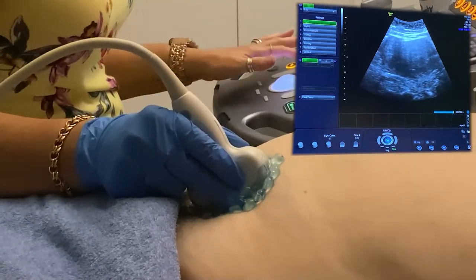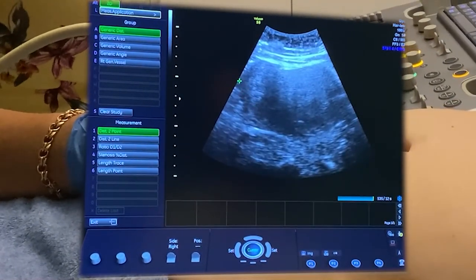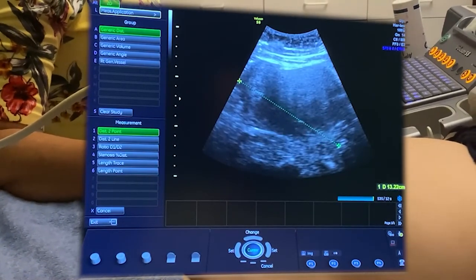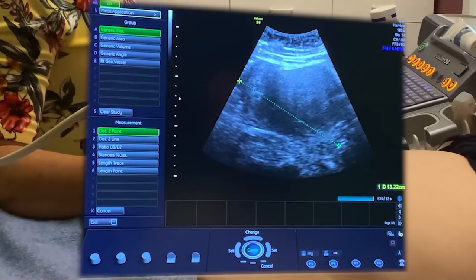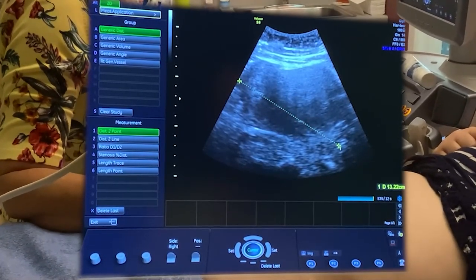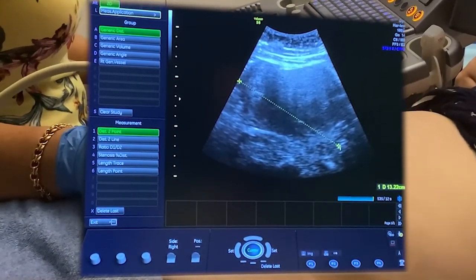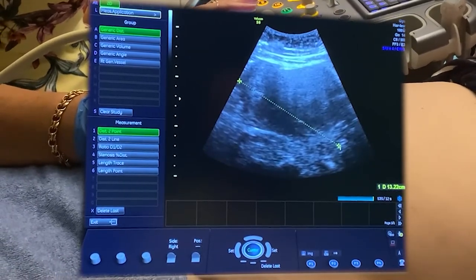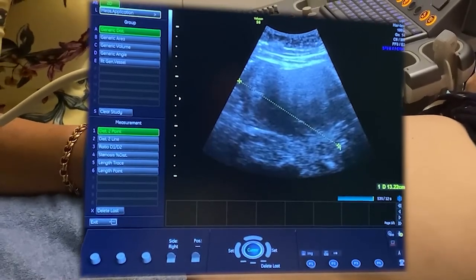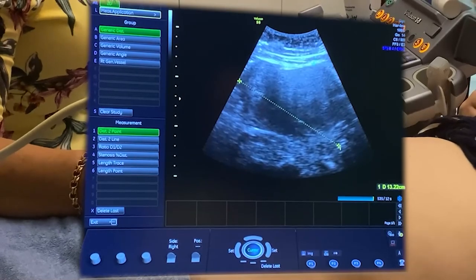But with the fibroids, as we measure, and I'm just doing a simple two-dimensional measurement to get the length, her uterus, even though it's got multiple fibroids, and we're going to include the cervix in the measurement because the cervix is actually part of the uterus and not independent from it. If I were doing a volumetric measurement for the uterus itself, I would exclude the cervix. But in this case, I just want to see the overall length to give me an idea of how beneficial my vaginal scan will be.